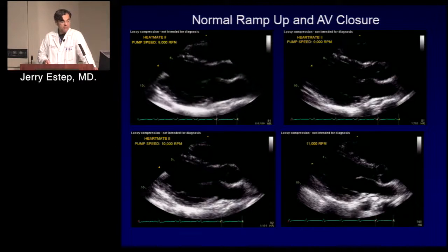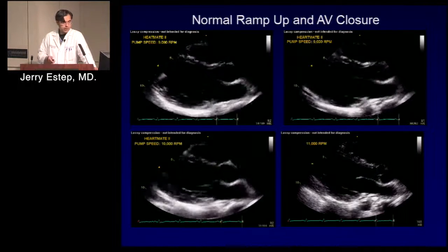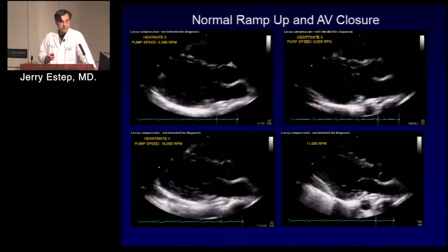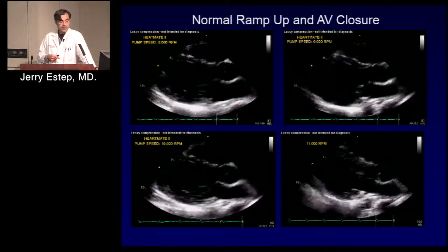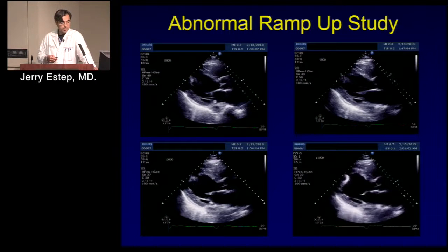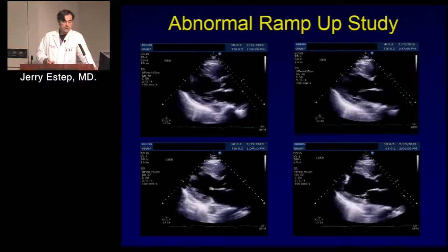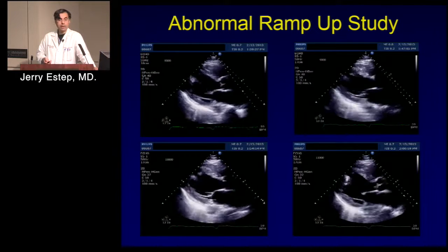So here's an example of nothing changing visually by 2D, and then an appropriate change. What you can appreciate, and I think the most specific, is the aortic valve. This patient had some myocardial recovery, ended up having their LVAD taken out. But at high pump speed, look at that aortic valve. That's closed. So you should see that in a normal functioning heart. That's in contrast to this particular patient, where Dr. Q, just like you mentioned, 8, 9, 10, 11, nothing's changing. You can quantify it, you can look at it, but for me, what I would hang my hat on is that valve is opening to the same degree despite a high pump speed.